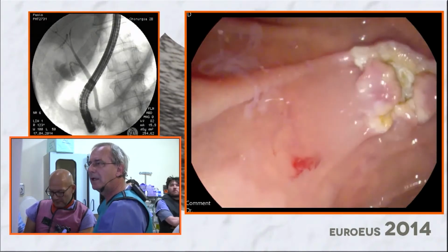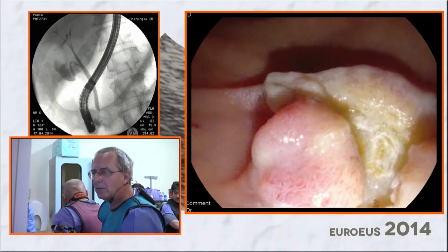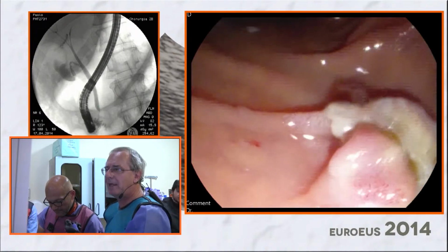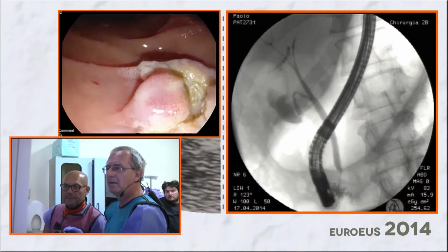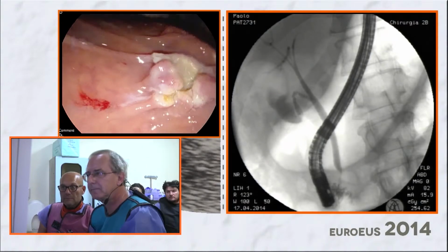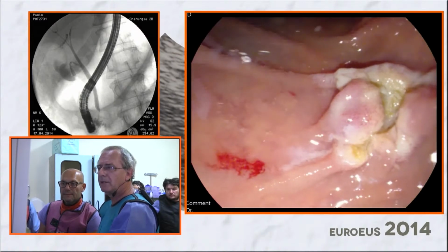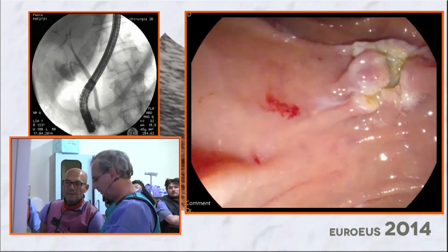So, no. Adesso guide wire. You see here on the flat part of the resection, this is probably the pancreatic duct orifice because the bile duct is probably here. So this one should be the pancreas. But we will see. We will try to cannulate with a guide wire. Of course, in these cases you have to go back in less than 3 months or 3 months.